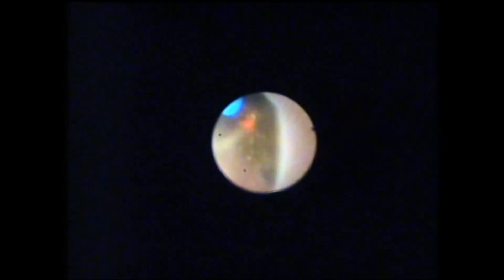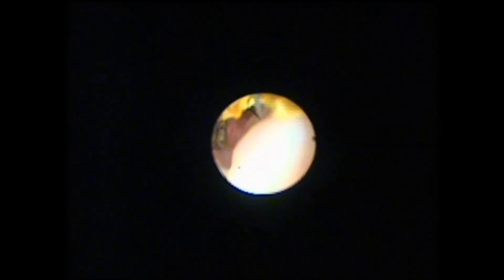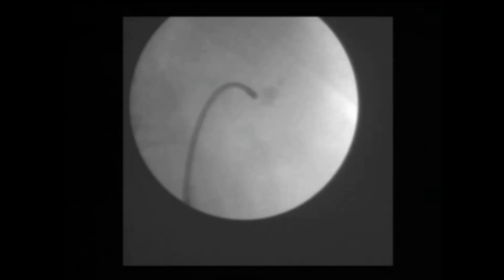In case of a large bulk lower caliceal stone, as in the present case, the stone is fragmented initially into smaller fragments. These fragments are then repositioned into the upper calix for further fragmentation. A tipless nitinol basket is used to retrieve these fragments from the lower calix.